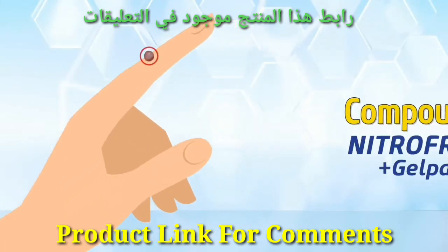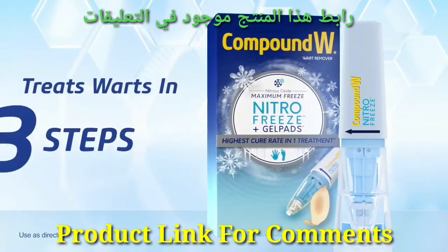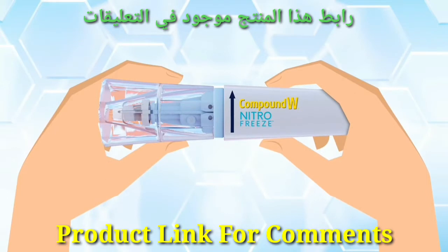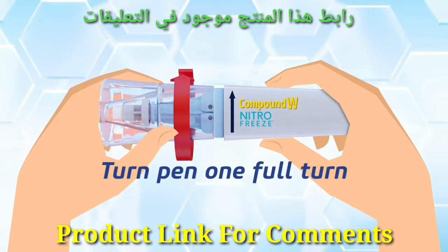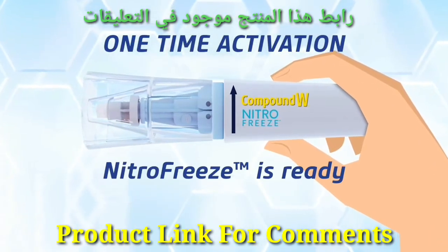If you have a wart, rest assured, because Compound W Nitro Freeze Plus Gel Pads comfortably treats warts in just three steps. First, activate the pen by starting with the cap on and turning the pen one full turn until you hear a click. This is a one-time activation. Now Nitro Freeze is ready for use.